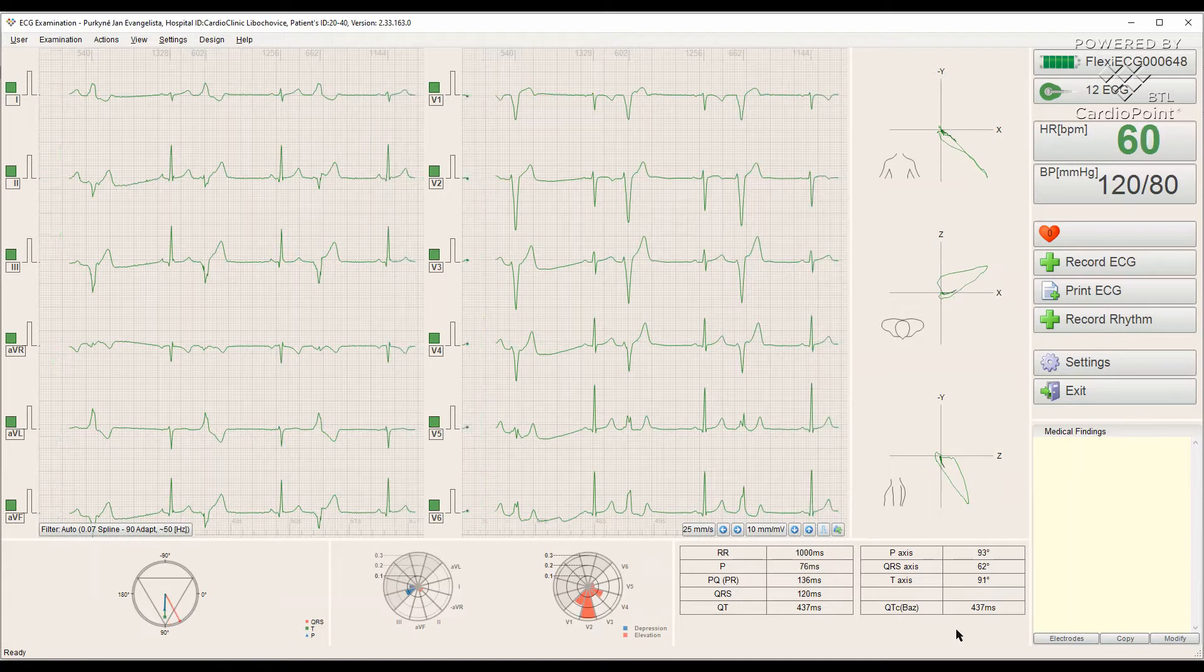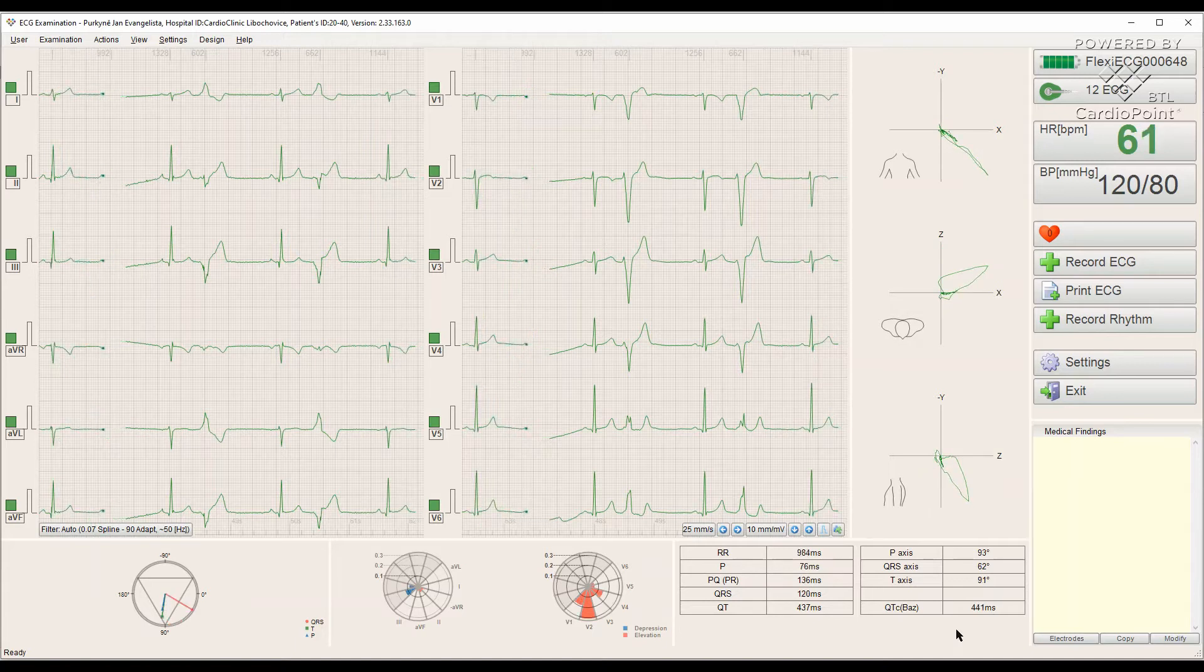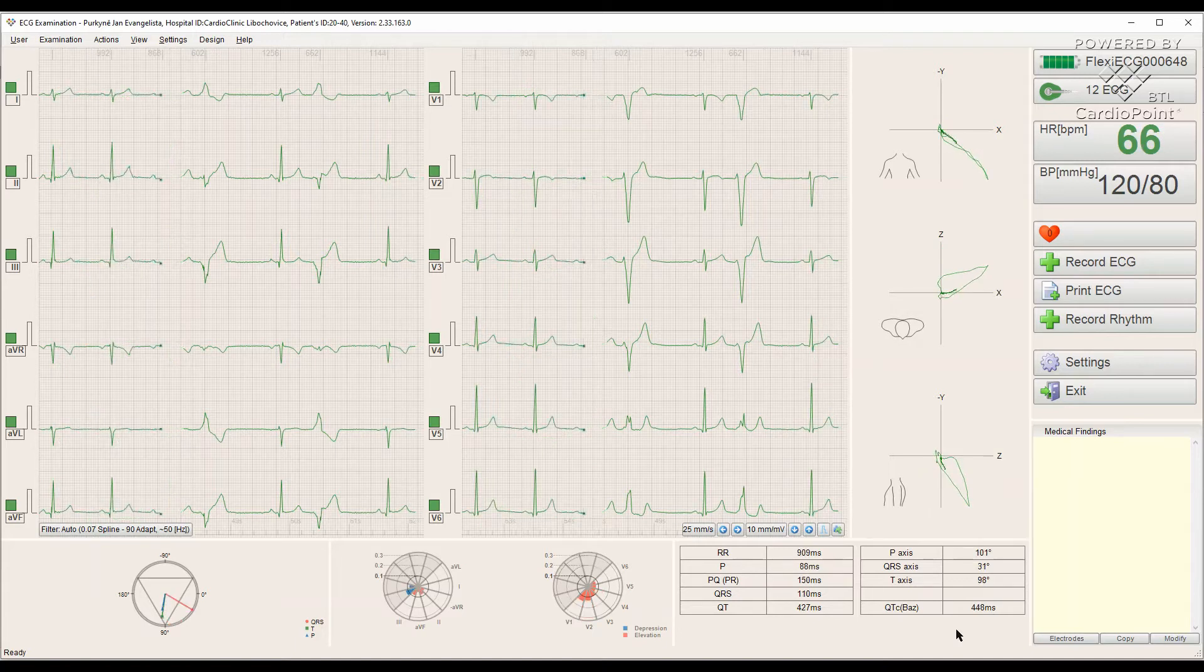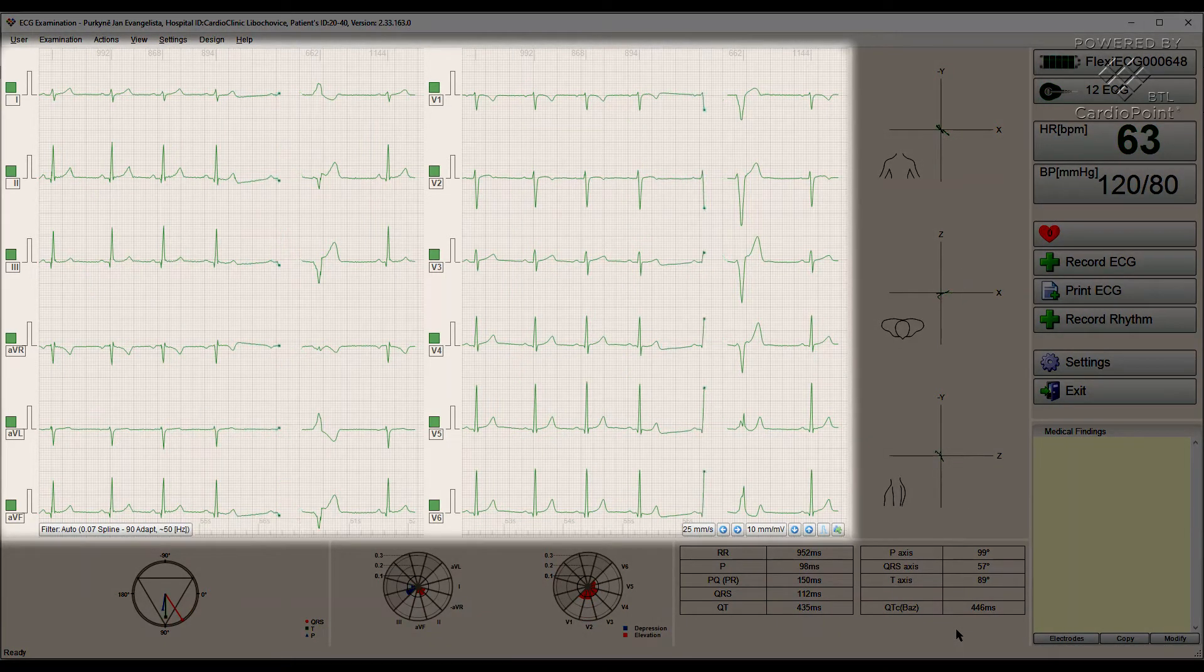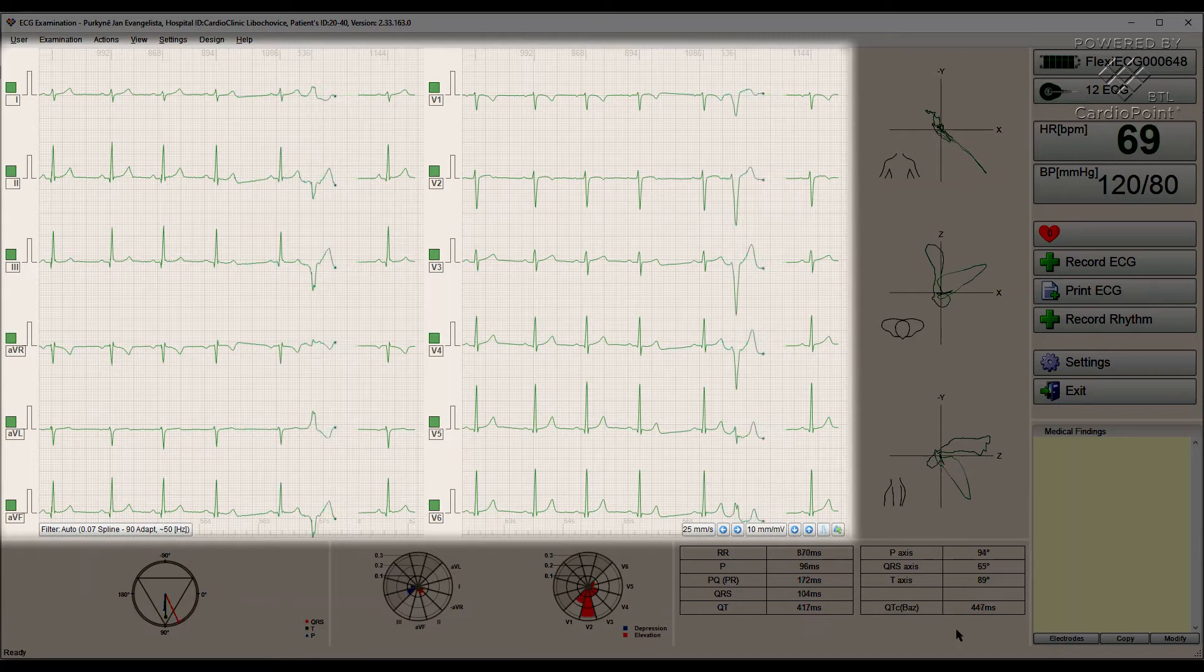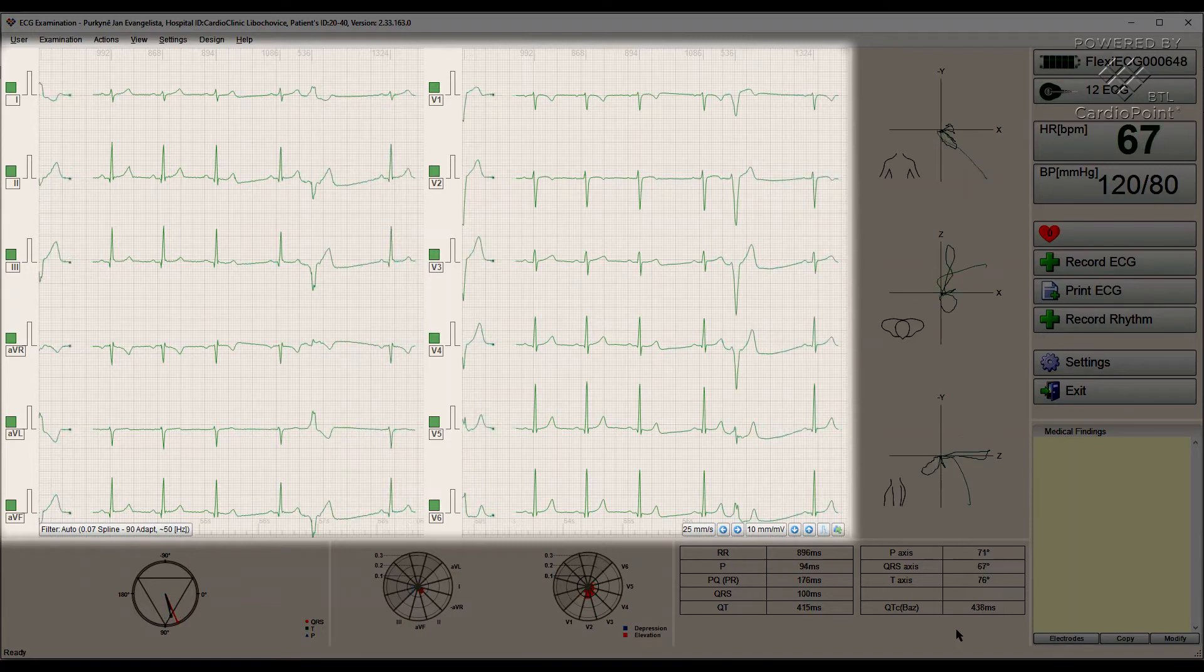Here we can see everything what we need at one place. In the middle, the ECG signal screen where we can observe heart activity.